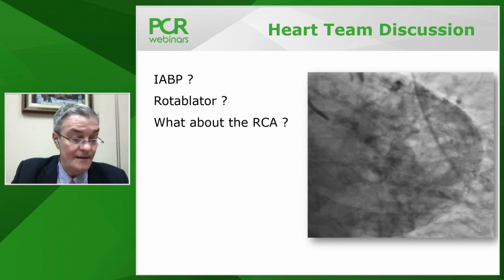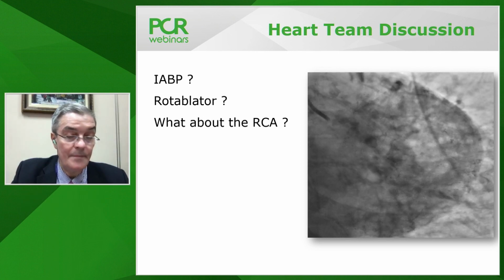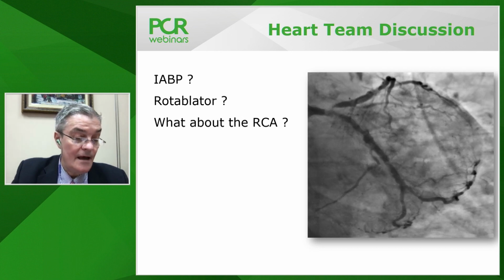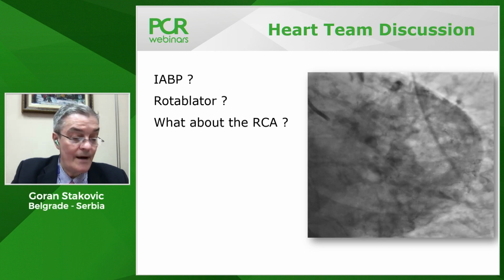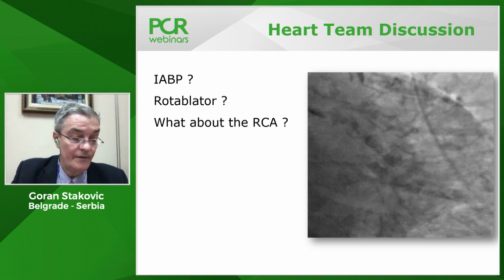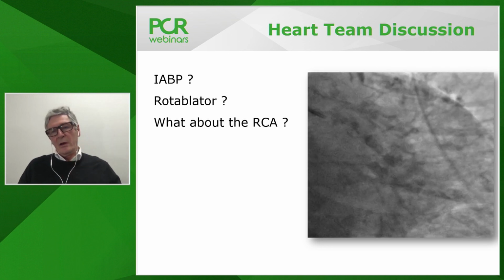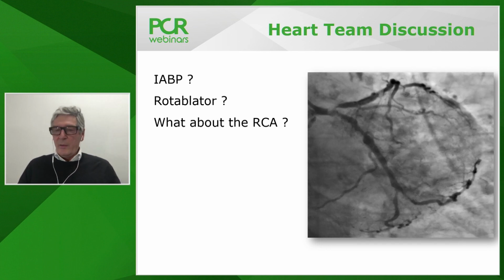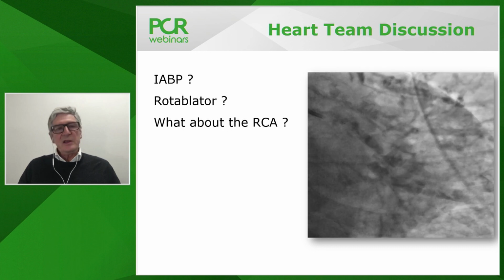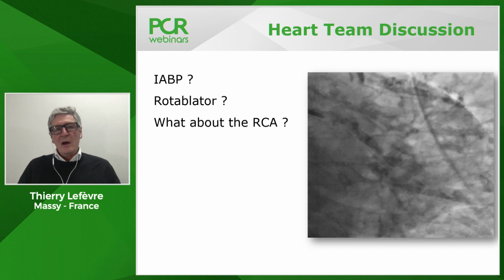We already started receiving questions from our audience. Rafal is asking, should we use Impella? It's a very high-risk case. And Dr. Ashish also asks, why can we not use Impella? Thierry, what was your thinking regarding use of Impella? I think Impella can be a useful approach, but in terms of safety, it's about the femoral arteries.